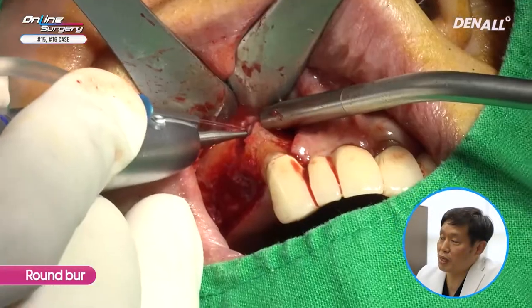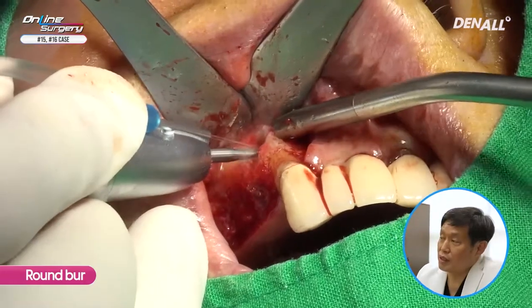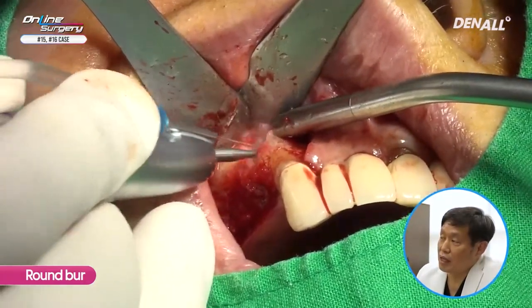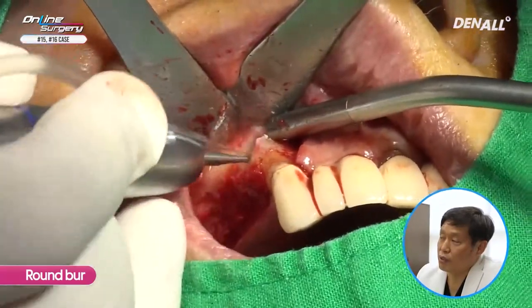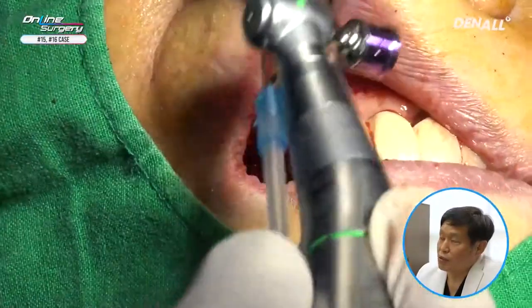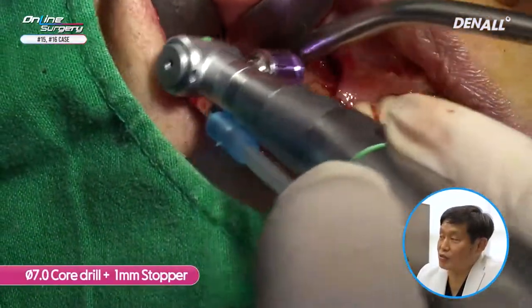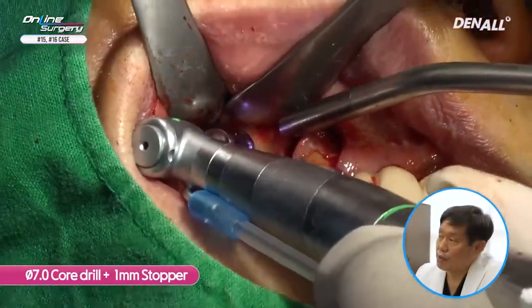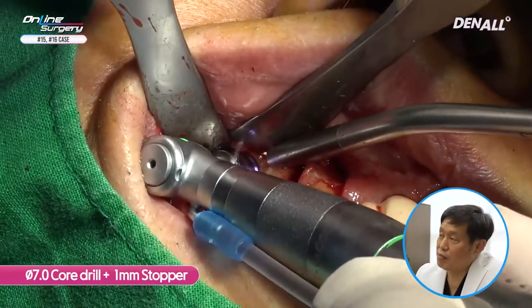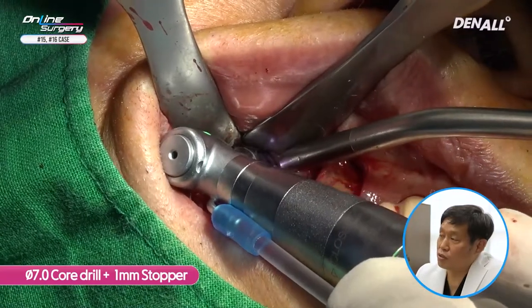There may be apical lesion left, so I'm going to use a round bur with a straight handpiece. I'm doing apicoectomy on the canine root. The preservation division may do retrofilling, but I just remove it. I'm using the LASKIT drill — 7mm core drill with 1mm stopper — to form a window.